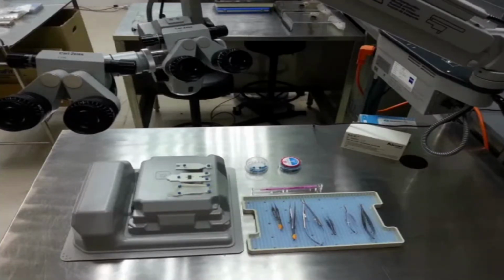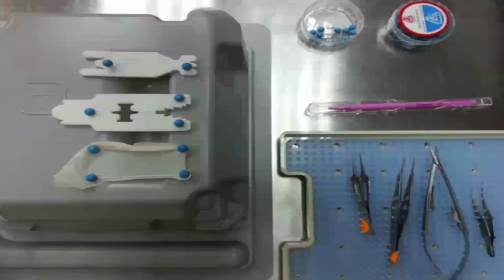So how do you do surgery? In our wet lab, I can tell you that we have functional microscopes, and all the microscopes have a teaching piece as well. The senior or whoever is teaching you can have a look. So these are the general settings. Last time I used to bring them to see all these things, then they know how to set up. Basically, all of this is by your creativity. You can use a banana skin, whatever thing that you think the feeling of it is quite similar to the eye or even eyelid surgery. Then you can do a suture. You just make a nick there, and then you do a surgery.